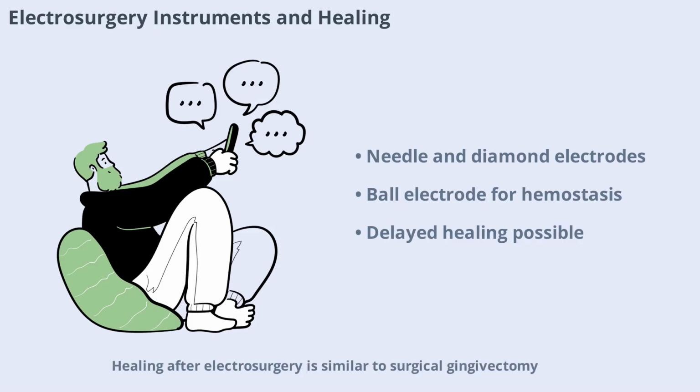Healing after electrosurgery is similar to surgical gingivectomy, but some reports suggest delayed healing, greater reduction in gingival height, and more bone injury. Careful technique and proper instrument selection are vital for minimizing complications.